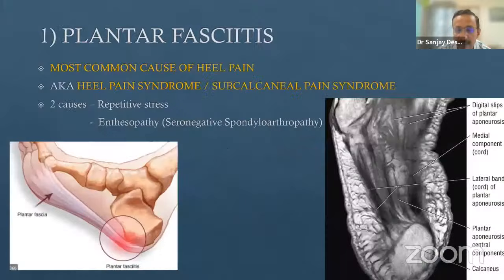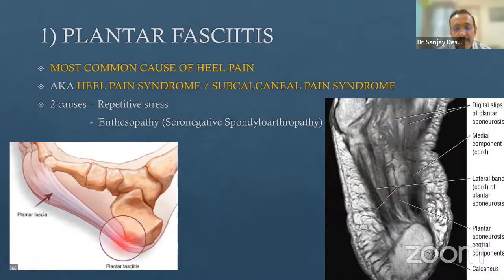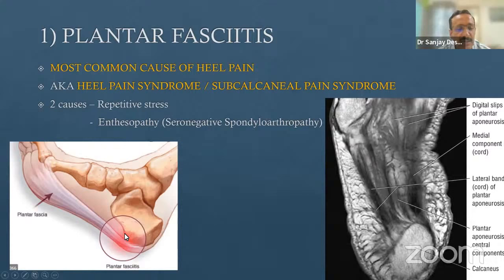Whenever the plantar fascia is more than four millimeters in thickness, it indicates thickening leading to plantar fasciitis or degenerative changes. It is the commonest cause of heel pain, also called heel pain syndrome or subcalcaneal pain syndrome. There are two causes: repetitive stress or enthesiopathy in the form of seronegative spondyloarthropathy. The plantar fascia is very important in maintaining the longitudinal arch of the foot.